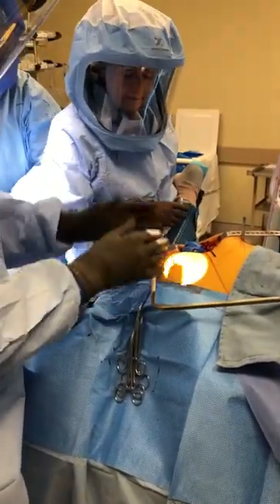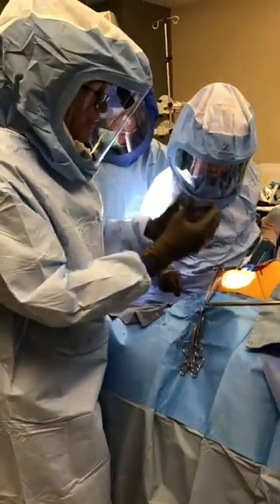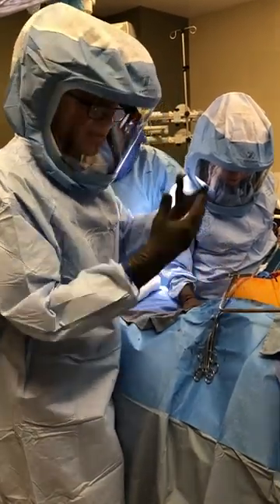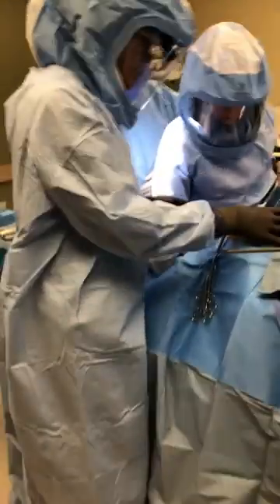We're done with the femur until we prepare the acetabulum, and then we'll come back. If we have to go down with the acetabulum, we could recut the femur to a smaller size — of course, we can't go up, only cut down. I'll just show you the implantation before it's implanted so you can see how it goes down.